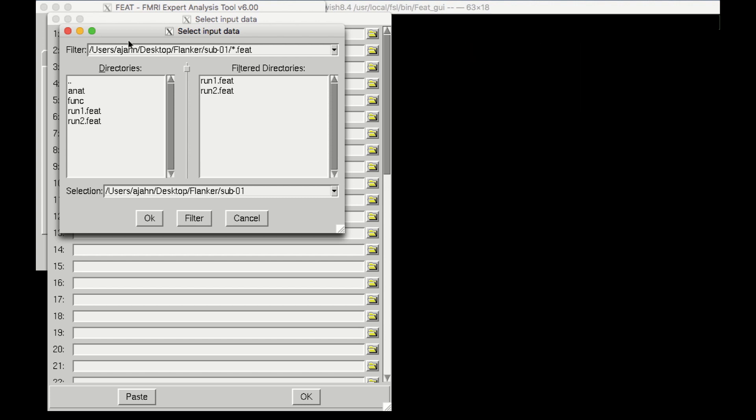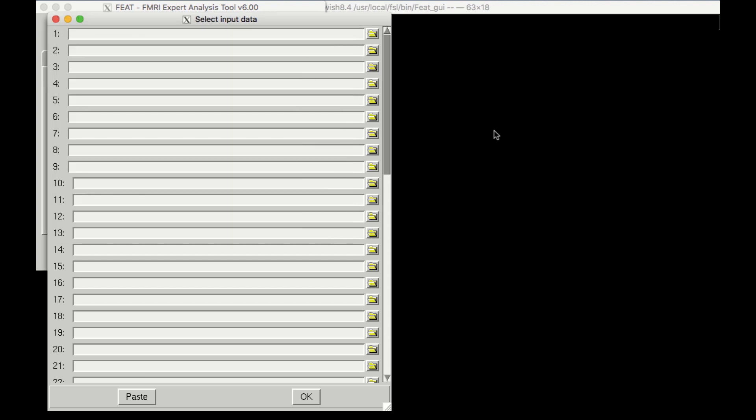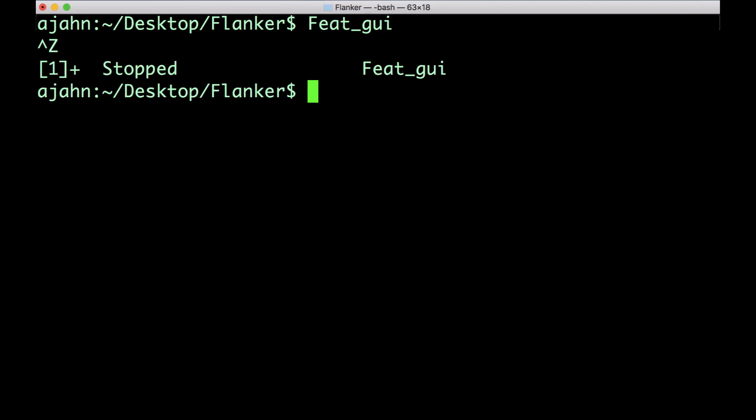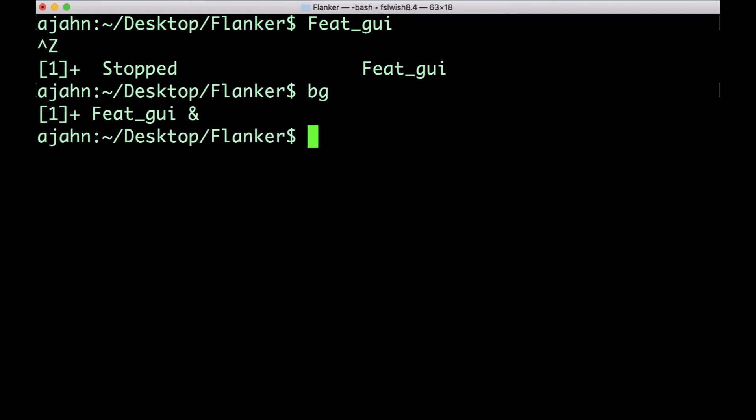Go back to your terminal that you launched the Feat GUI from, and type CTRL and Z, and then type BG and press Enter. This will allow you to type commands in the terminal while keeping the Feat GUI open.